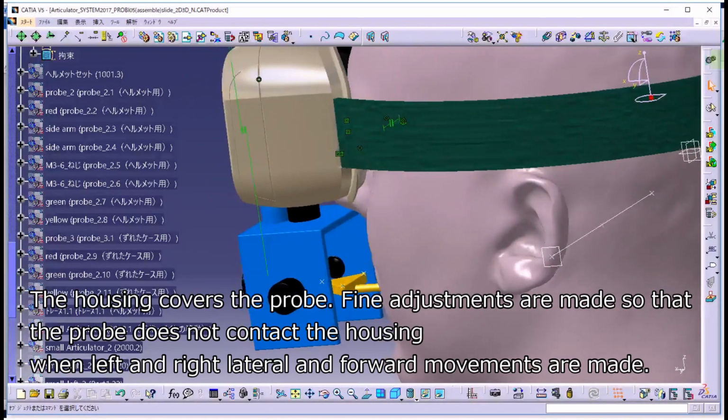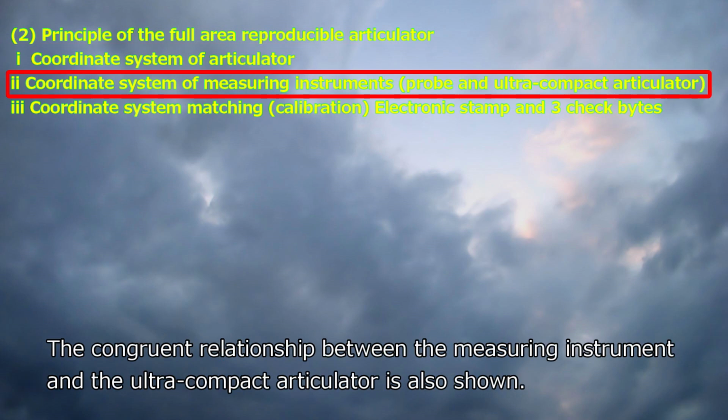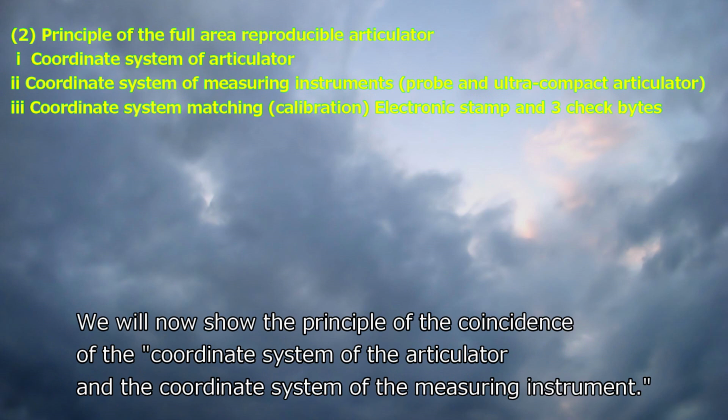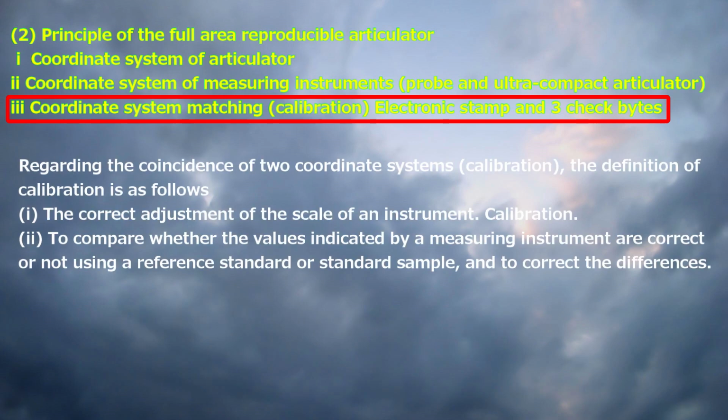movements are made. We have shown that there is a coordinate system for the articulator and a coordinate system for the measuring instrument. The congruent relationship between the measuring instrument and the ultra-compact articulator is also shown. We will now show the principle of the coincidence of the coordinate system of the articulator and the coordinate system of the measuring instrument. Regarding the coincidence of 2 coordinate systems, calibration.